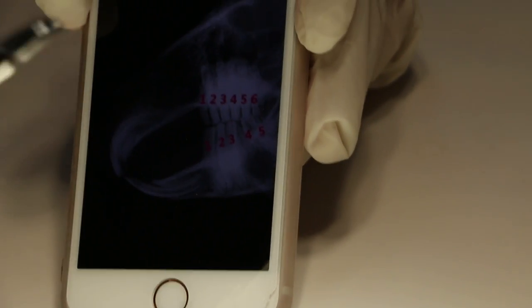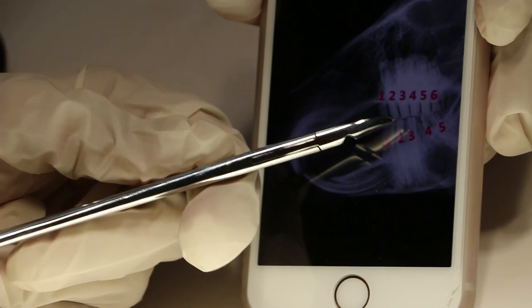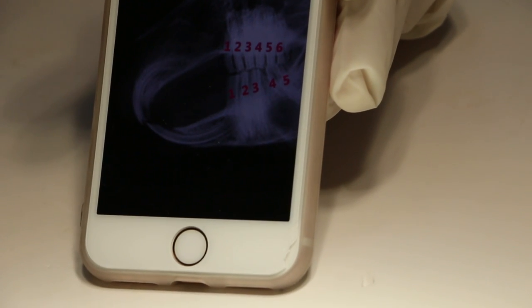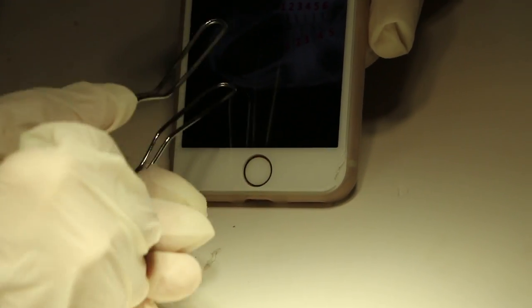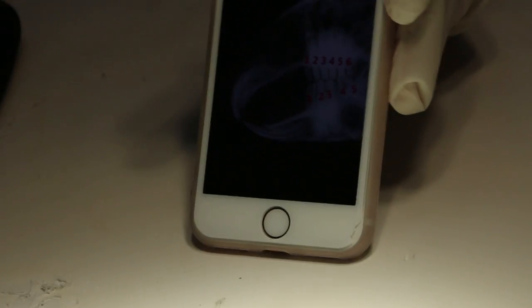The last one would be the molar cutters for molar spurs — to cut the sharp ends of the molar. This one cuts the edges if the molars are sharp or overgrown. There are different sizes. The wire mouth gag also comes in two sizes: extra small and small. All done — we will now take the rabbit out and demonstrate.